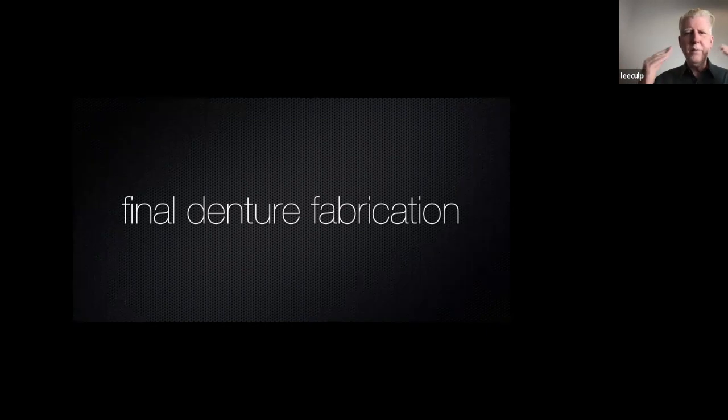You're going to bite, adjust whatever you need to do to get the bite right, and make any marks on midlines or whatever. But then, the reason you want to do a wash is because we have to rescan and we have to start over. So we're going to mark everything. We're going to use the same mold of teeth and put them back into the position you had them in the first place. But if the bite's wrong, we start over. If the bite's right, we can do anything you'd want and pop it right back out to you. So important to know in digital dentures.